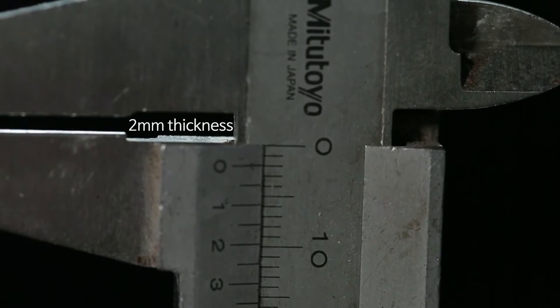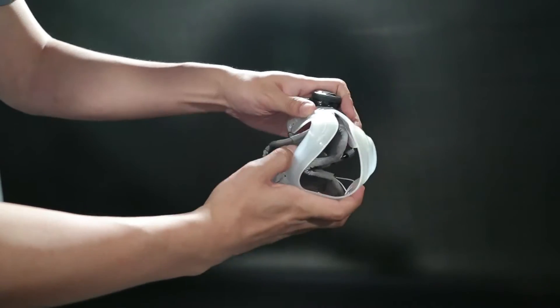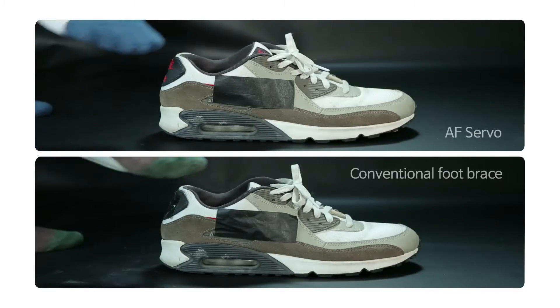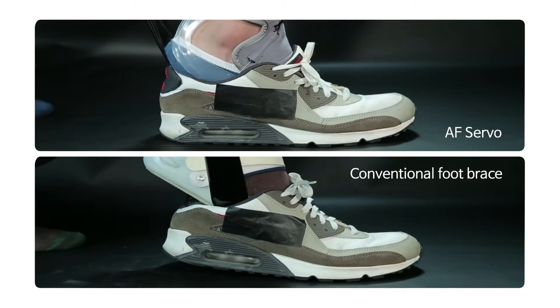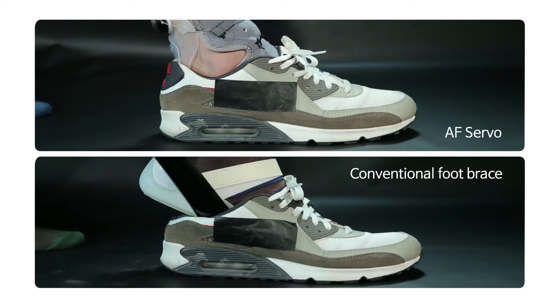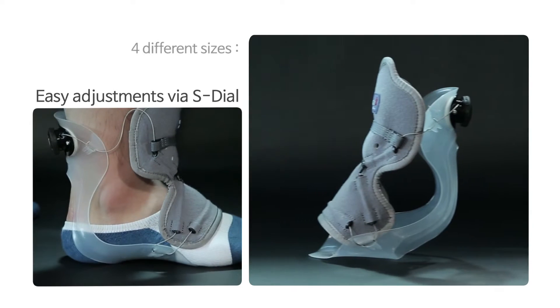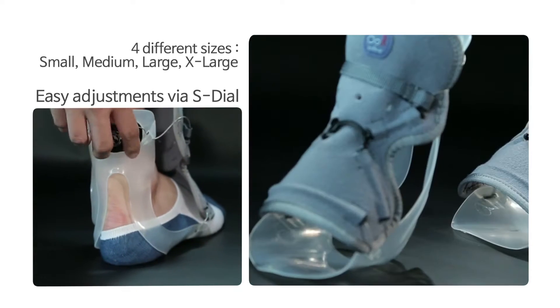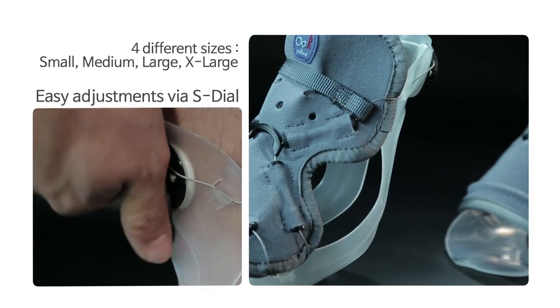It's thin and light and incredibly flexible, making it easy to wear with shoes. Compared to conventional ankle braces that cost a lot and take much time to put on, the AF Servo takes a fraction of the time to put on. Most of all, the dial closure system makes it simple to tighten and loosen. Even hemiparalysis patients can put them on without any assistance.